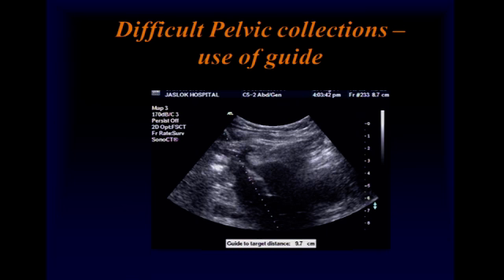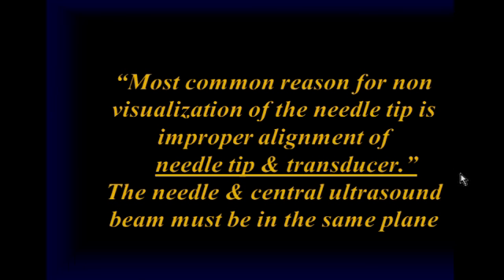Guides can also be used when you are negotiating through a very small area. Here, for example, in the abdomen, the window is very small, so if I don't want to make any mistake, I can use a guide on my probe.